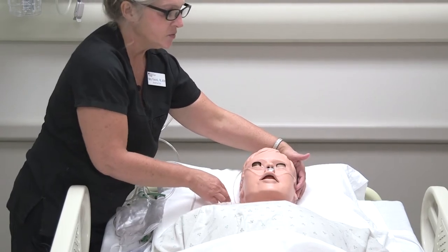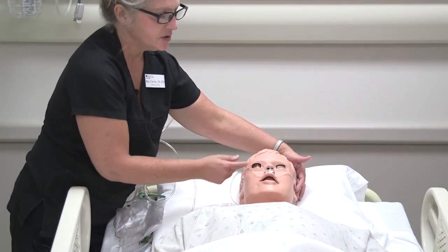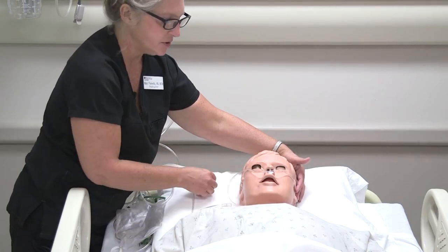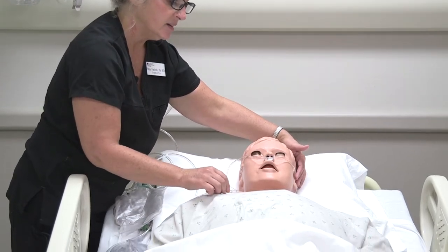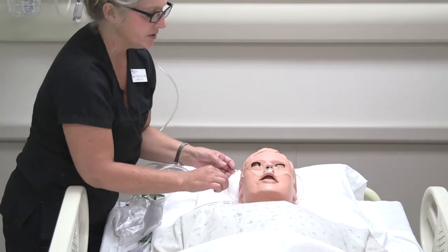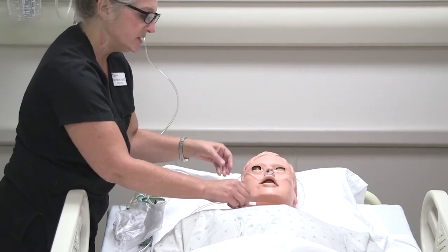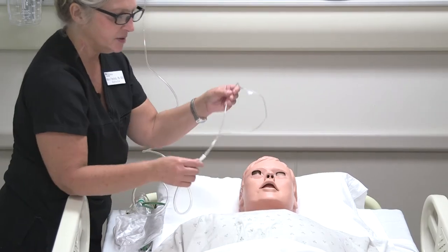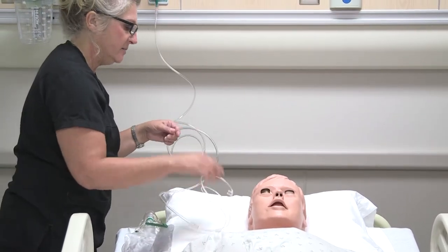With nasal cannula, you want to make sure you're looking for dryness. Sometimes there'll be excessive dryness. If you are at a level of four liters or more with the nasal cannula — like four to six — you can add humidification to make it less dry.